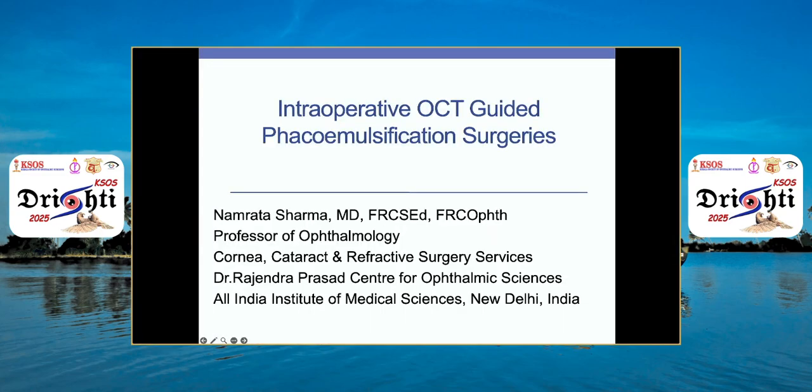You don't necessarily need an intraop OCT microscope; it just helps you understand the dynamics better. The important thing to understand is that all your diagnostics are now marching into your operation theatre and getting wedded to it.